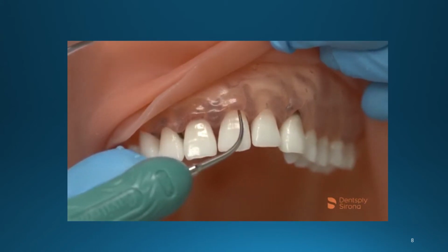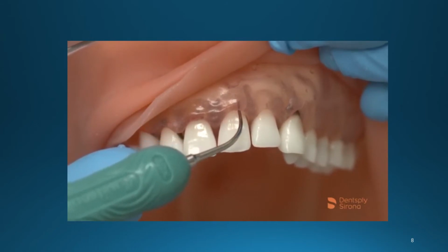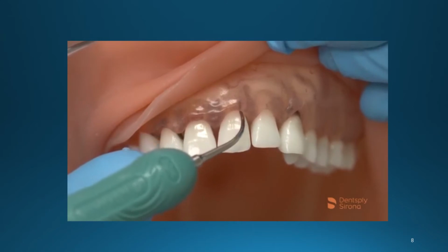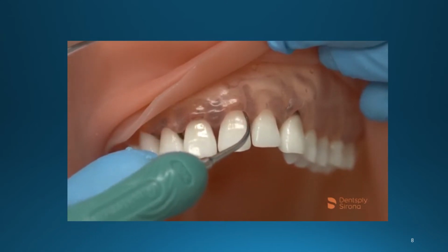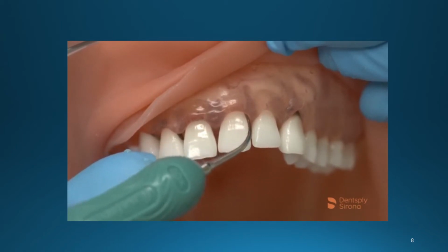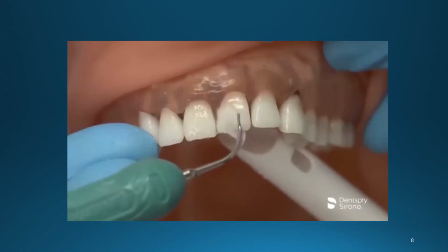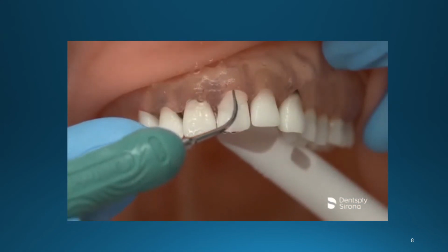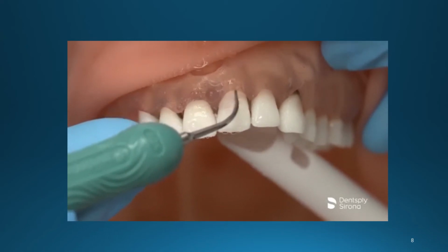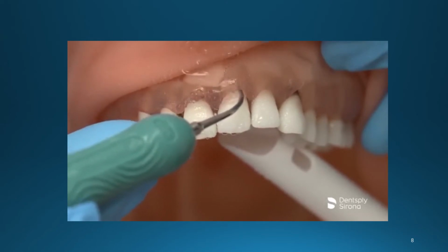Depending on the patient presentation, the clinician will enter the sulcus or pocket in either a vertical or transverse approach. For demonstration purposes, we are utilizing the vertical approach for the patient with deeper periodontal pockets. As the clinician enters the sulcus, it is essential to assess the anatomy as the insert travels to the base of the pocket. If calculus is encountered, the clinician engages the terminal end of the deposit in a light tapping approach, followed by small sweeping strokes to provide lavage and assess the removal.